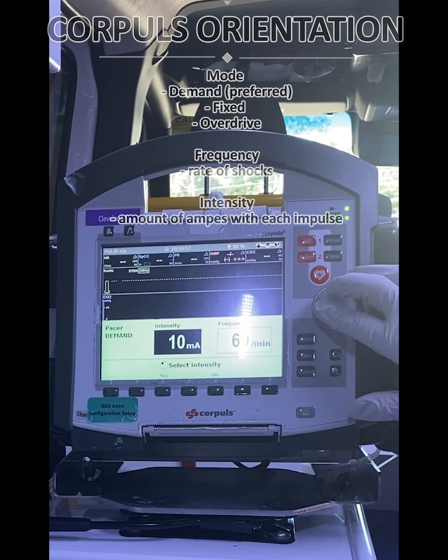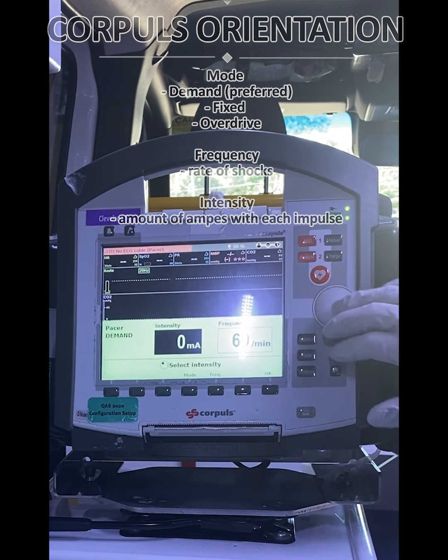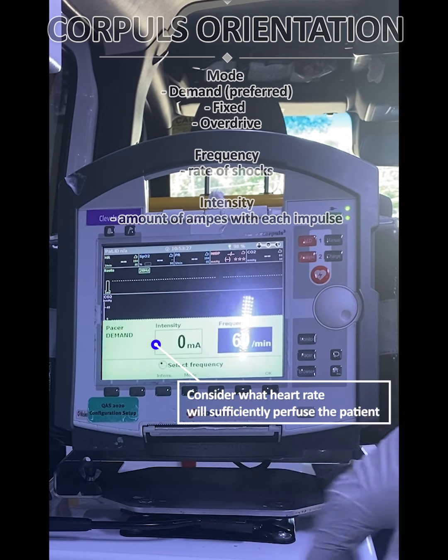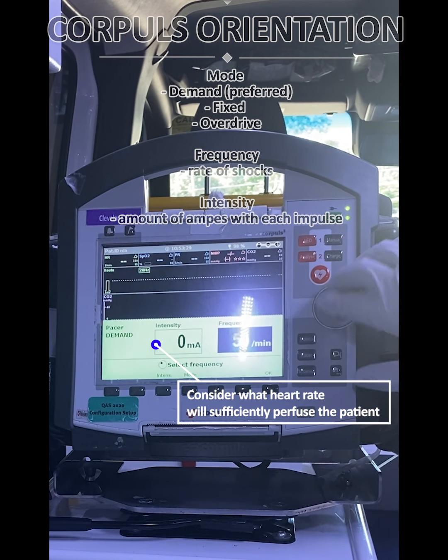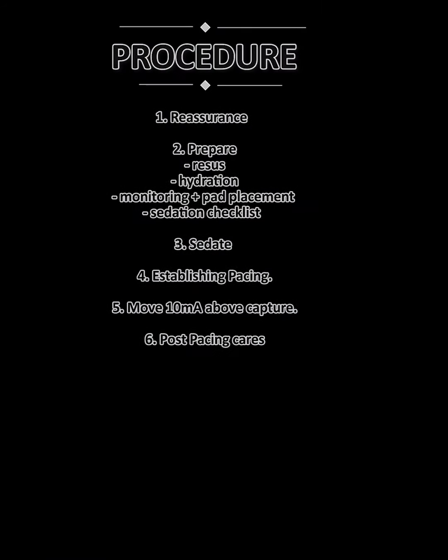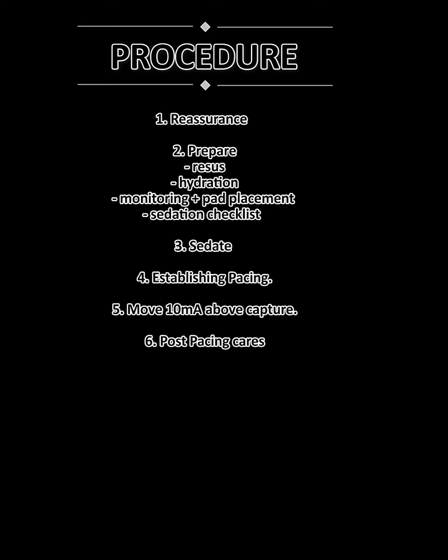We have intensity, so we can go to 10 and then 5 milliamp increments. We want to escalate this up to the point where we are finding capture, which we'll talk about later. The final component is frequency, and this is really just setting our heart rate, and usually 60 to 75 is sufficient for this. Here is a brief overview of the procedure that I'm going to go through today, including the pre-procedure phase, the procedure phase, and the post-procedural cares.